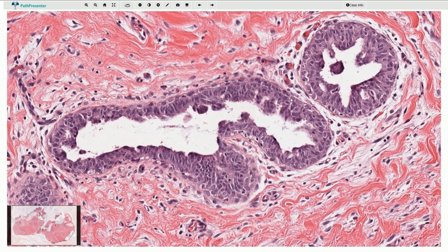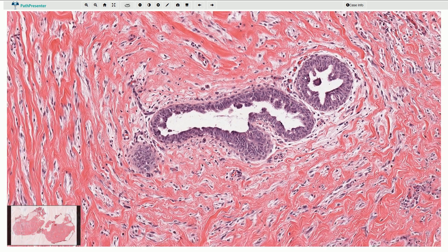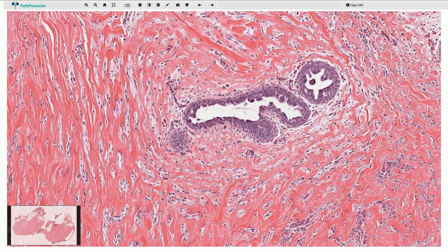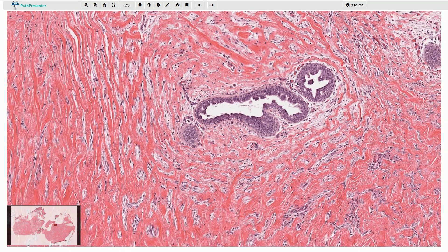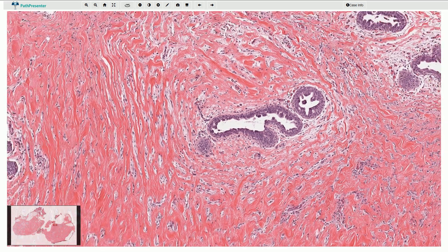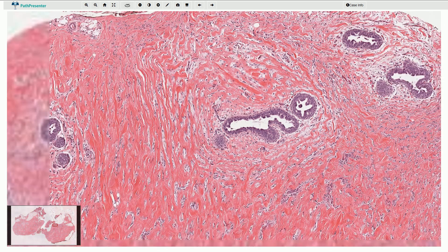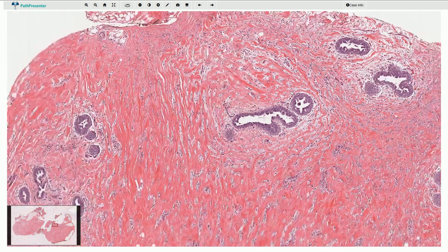So what is it? Is it some carcinoma in situ or even invasive carcinoma with a desmoplastic reaction? Well, not really. The most important clue to the right diagnosis is the fact that we are looking at male breast tissue. So this is a typical appearance of gynecomastia.